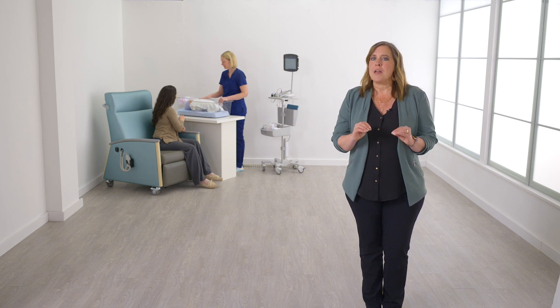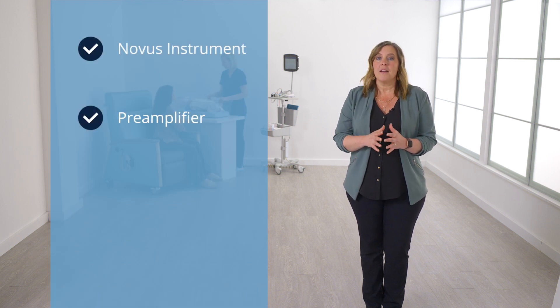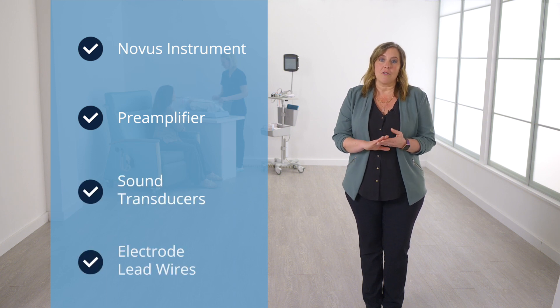To perform ABR testing with the Novus, gather the appropriate components and assemble. For ABR testing you will need the Novus handheld instrument, the preamplifier, the sound transducers, and the electrode lead wires.